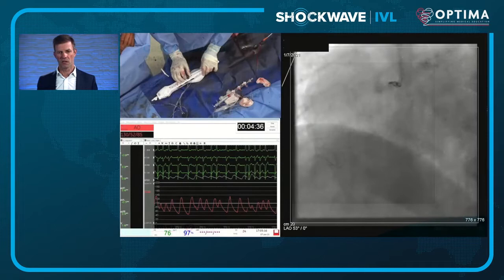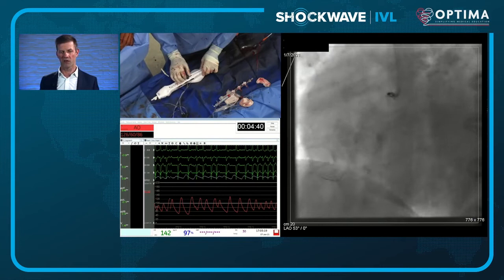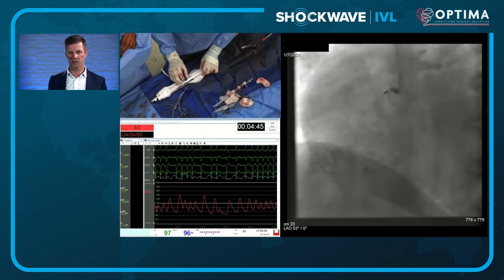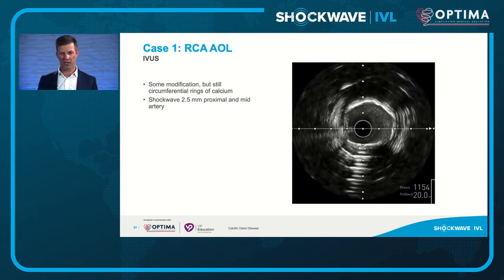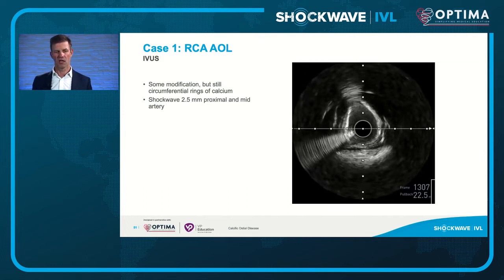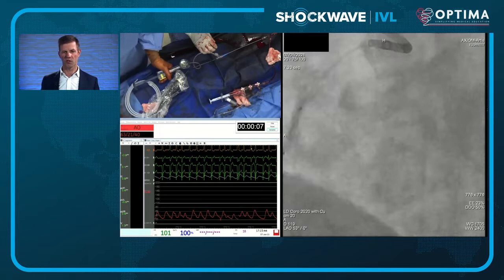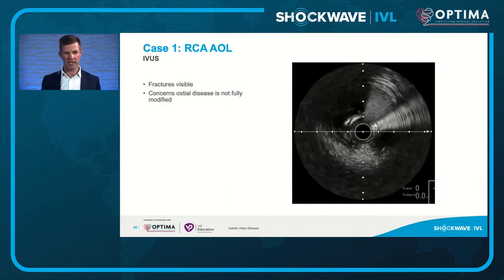After a long prolonged attempt, gently tapping away, the burr eventually passes — quite a relief. I then image to determine what further adjuncts are needed: has there been good calcium disruption for a good stent result? The answer is no — I need a shockwave balloon. I take a 2.5 millimeter shockwave and deliver 80 pulses along the length of the artery, and you can see the expansion of the balloon with delivery of the shockwave.